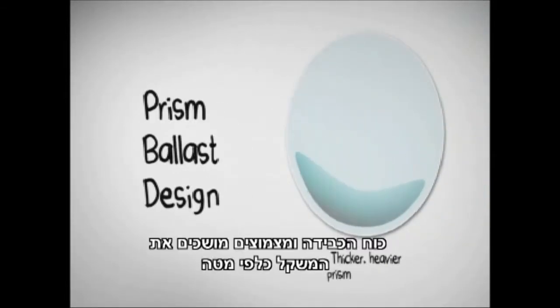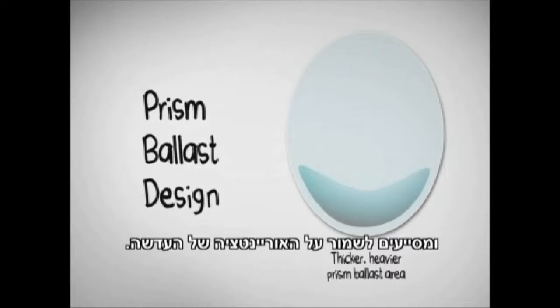See that little area? Gravity and blinking pulls that weight to the bottom, helping the lens stay orientated.